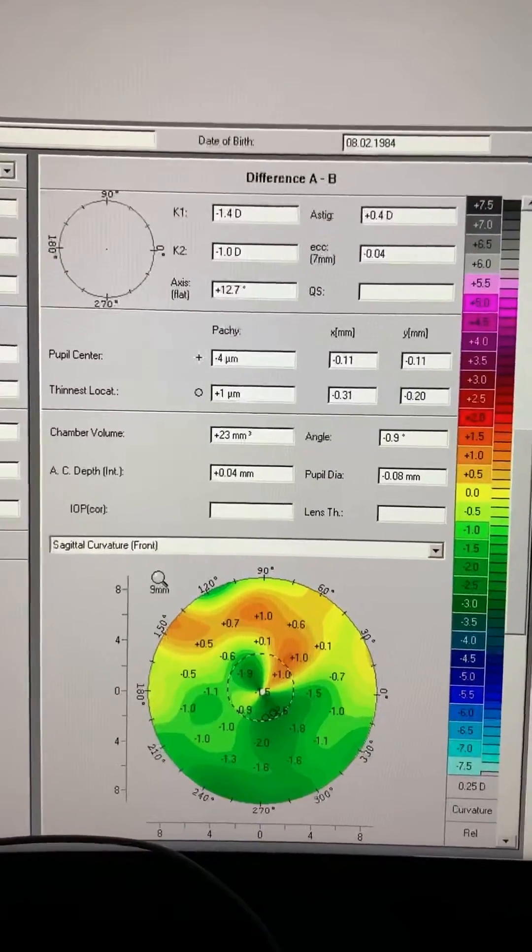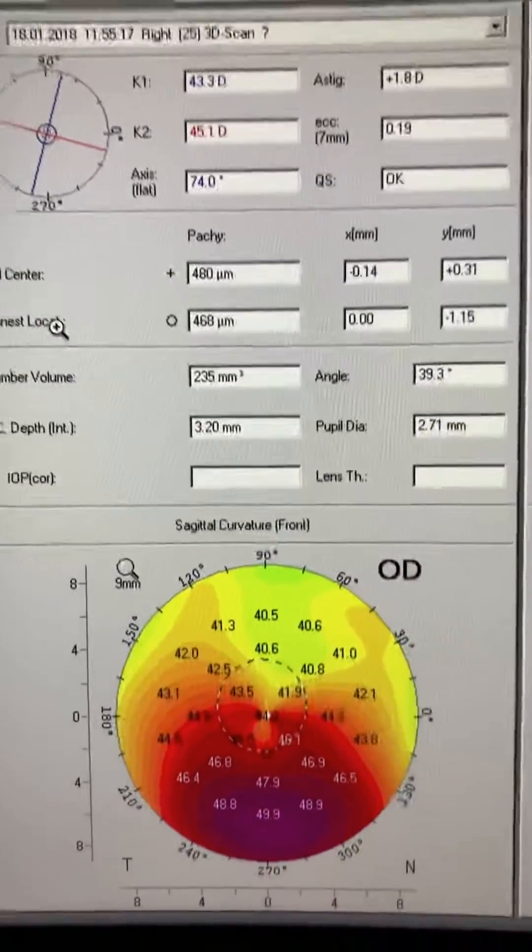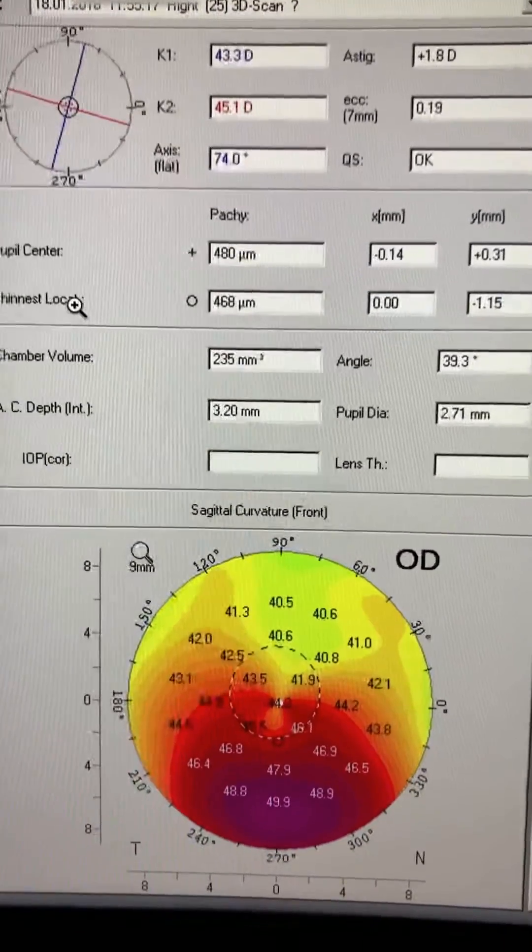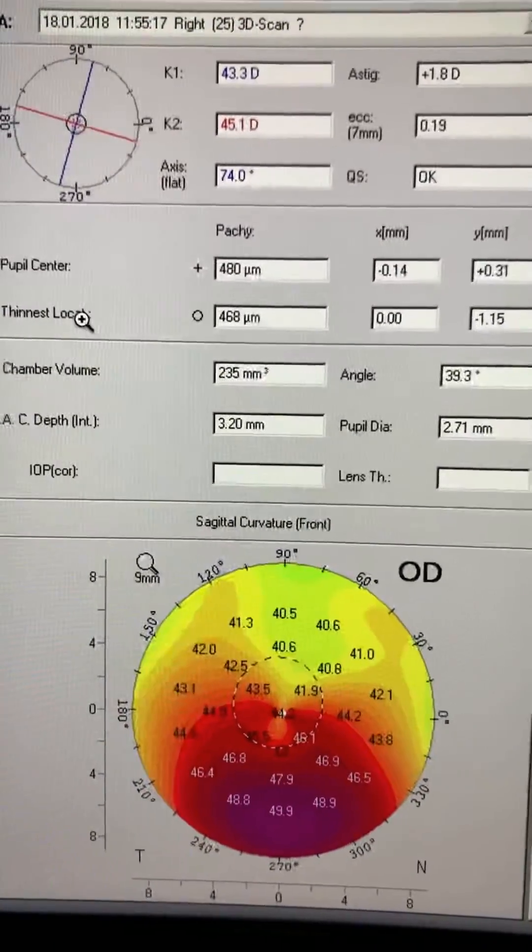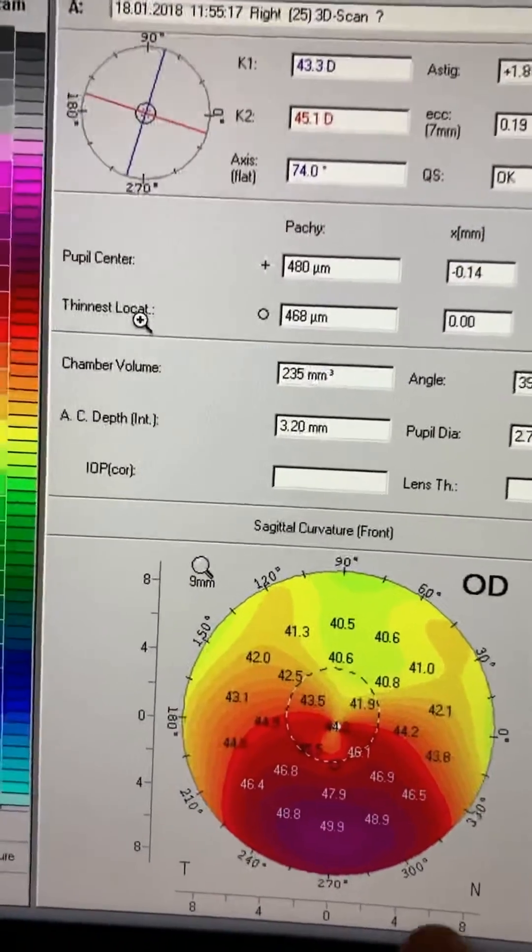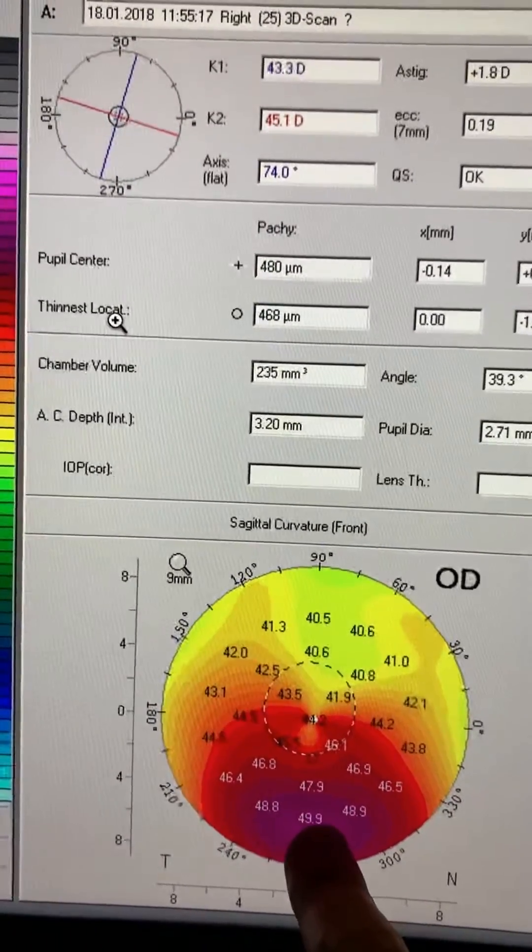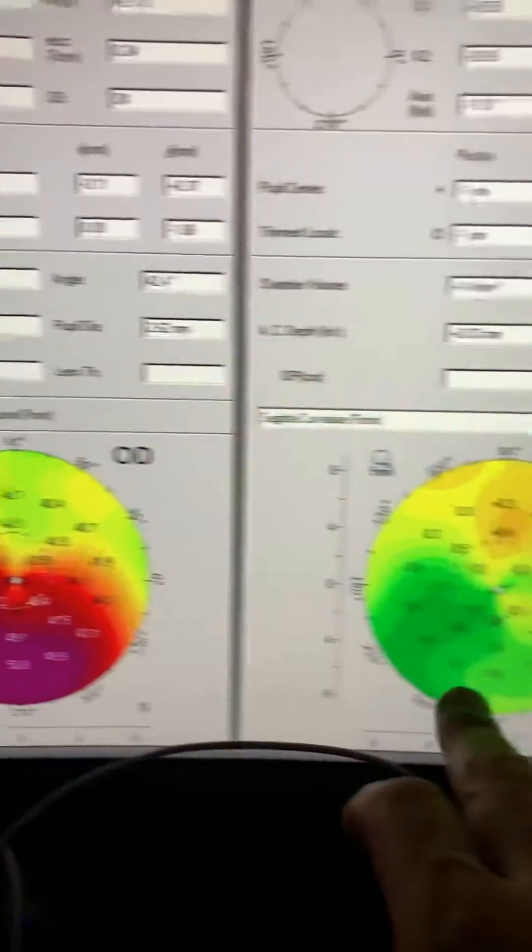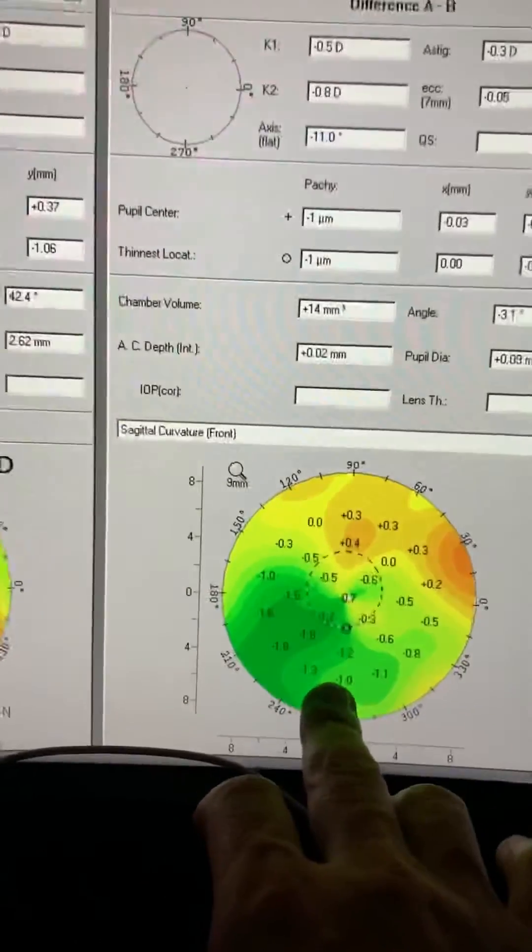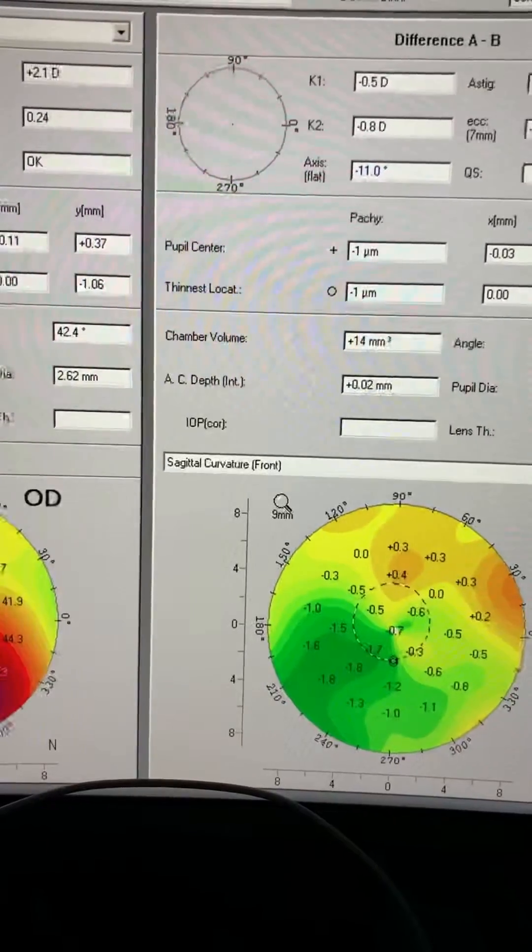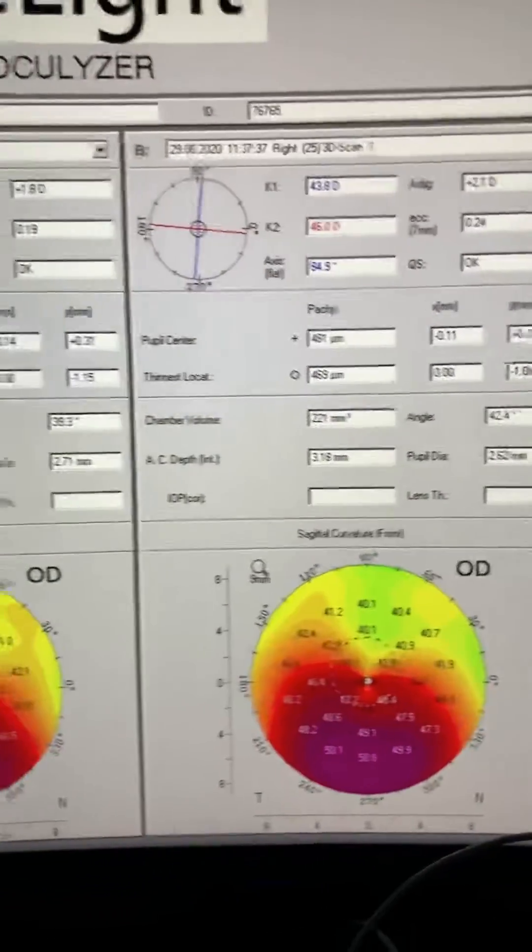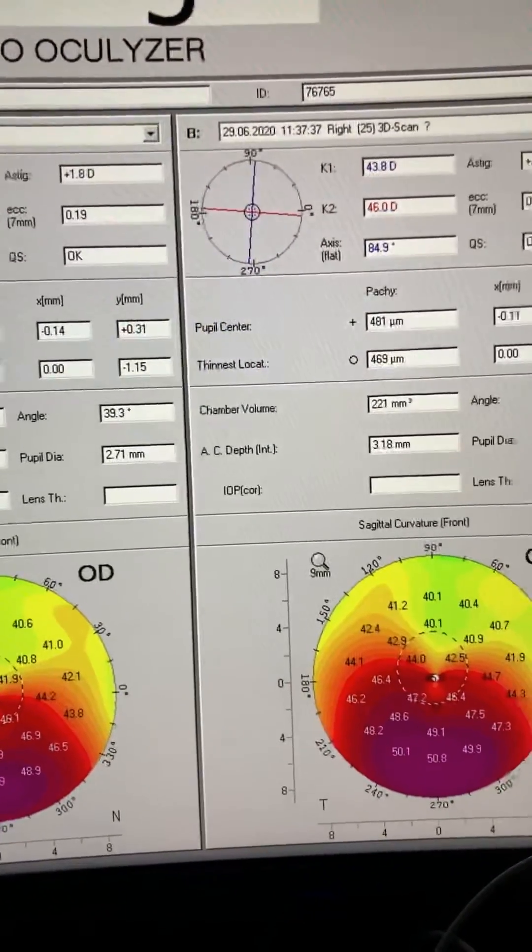And we're going to take a peek onto the right eye, which also shows significant changes. This is the right eye two and a half years ago, similar situation. Steepest cornea 49.9, now it's 50.8. There's over a diopter change, and the cornea appears to have similar thickness.